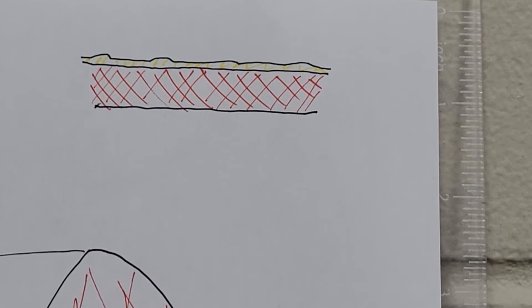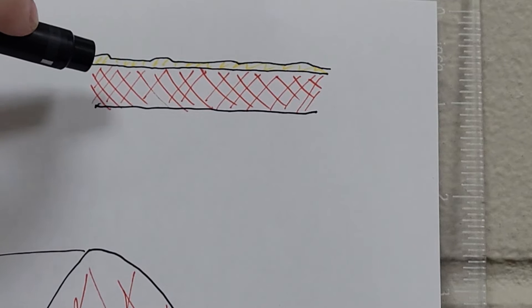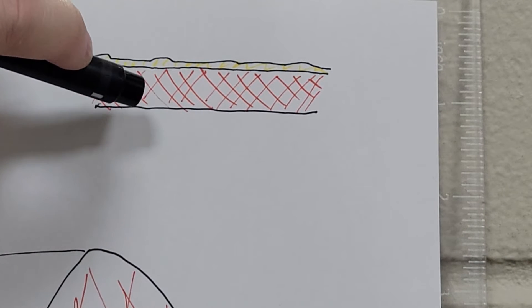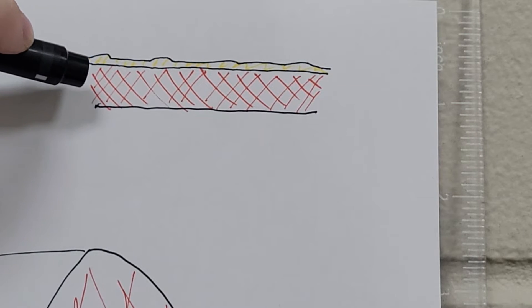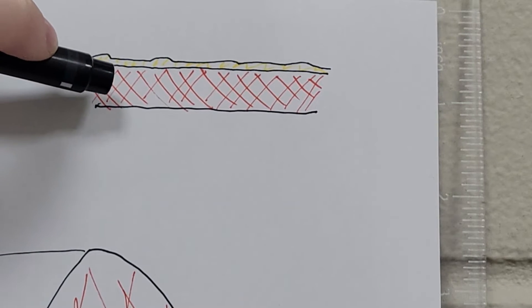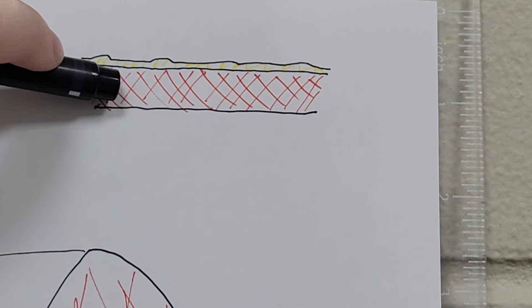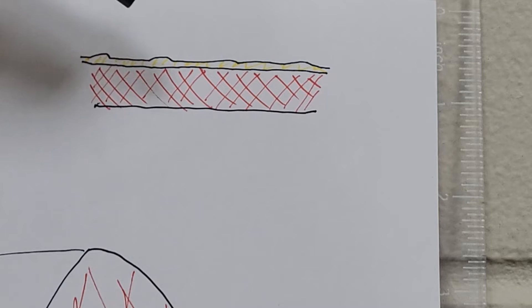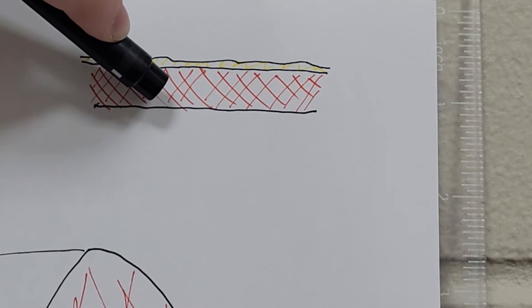When you're going into the muscle, you have to go through the skin. Chickens don't have much of what we call a subcutaneous space — they don't have much room between their very thin skin and down to the muscle. So when you're giving an intramuscular injection, you don't have to go very far. You just have to get through the skin and inject into the muscle layer.